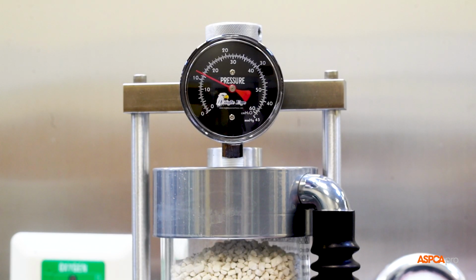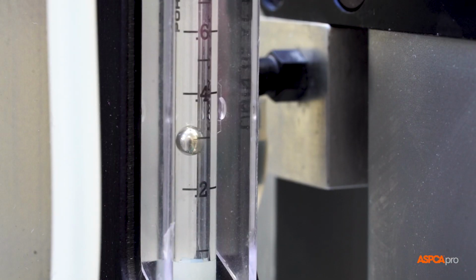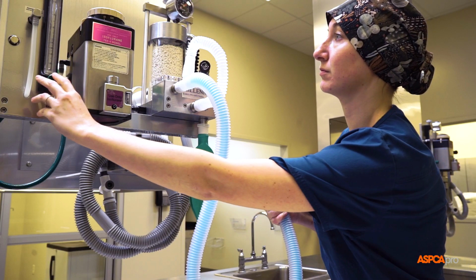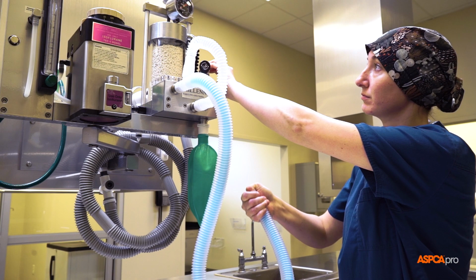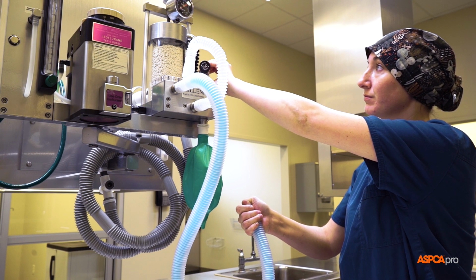If the system starts to lose pressure, but the oxygen flow can be set at 300 milliliters per minute on the flow meter to maintain pressure, the leak is within the acceptable range. However, if a flow rate higher than 300 milliliters per minute is required to maintain 20 centimeters H2O, you must locate and correct the leak before using the machine.